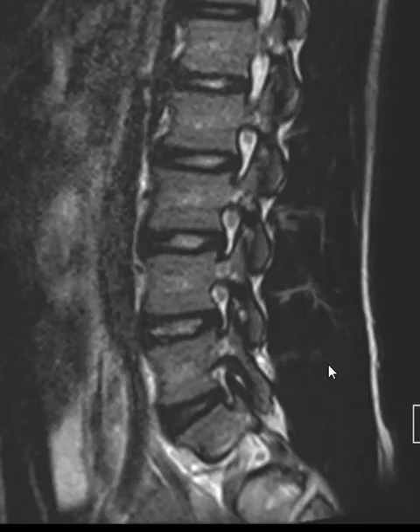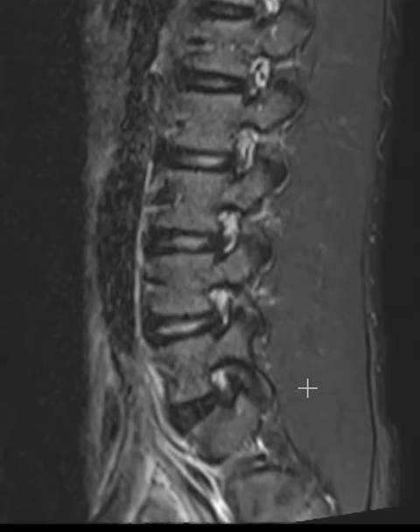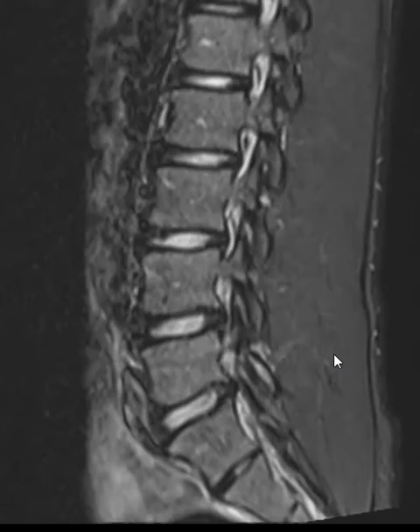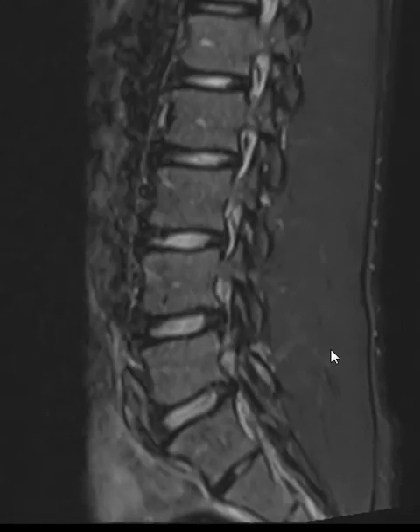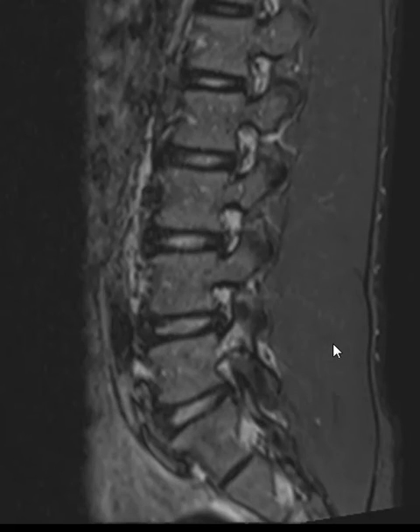There was another sequence here where it shows up better, which is the STIR. Here's the right-hand side looking good, midline, and off on the left you can see that glaze of marrow edema. But even then, if it was not windowed very well, you could jog right past it.